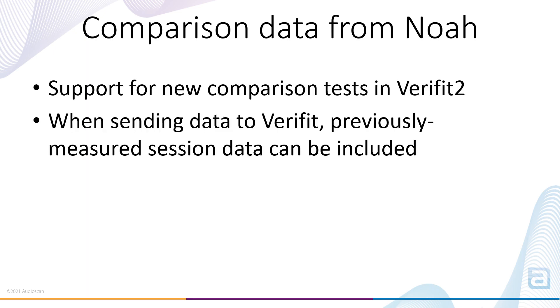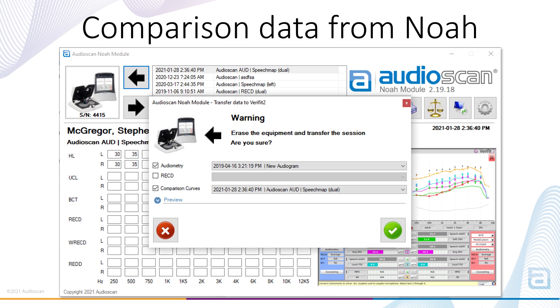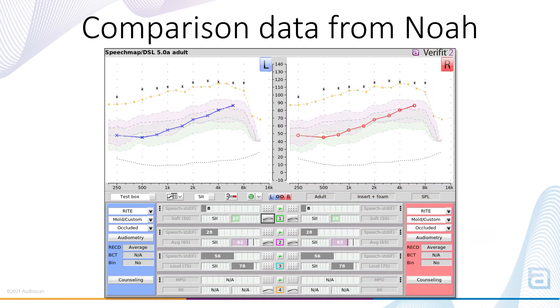The second and arguably most exciting update to the Noah module relates to the speech map comparison tests feature mentioned earlier. For the first time ever, previously stored speech map measurements can be sent back from Noah to the Verifit, and will automatically populate the comparison test slots in the Verifit 2 speech map screen. Underneath the audiogram and RECD selector is a third pop-up menu which allows the selection of the previously stored test data. Here's what the speech map screen would look like with a set of comparison curves pulled in from Noah, as well as the audiogram ready for new tests to be run.